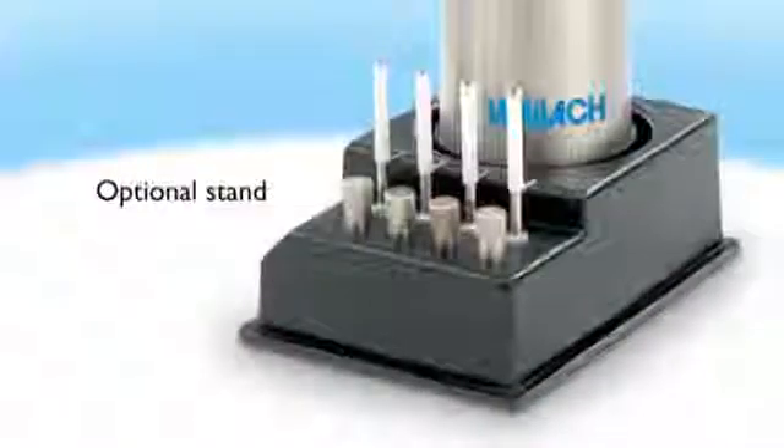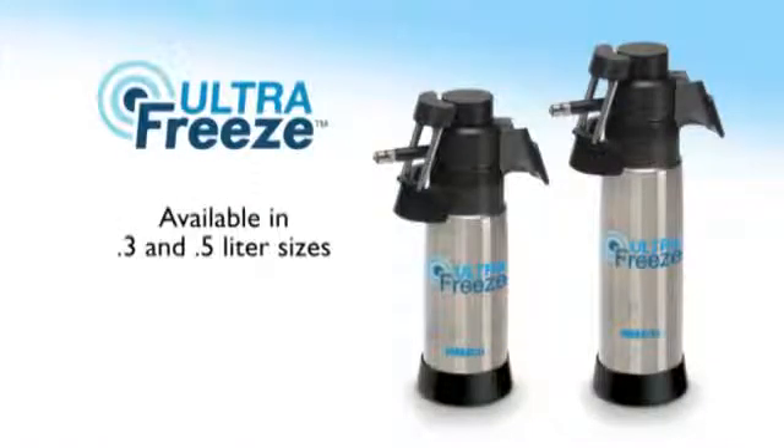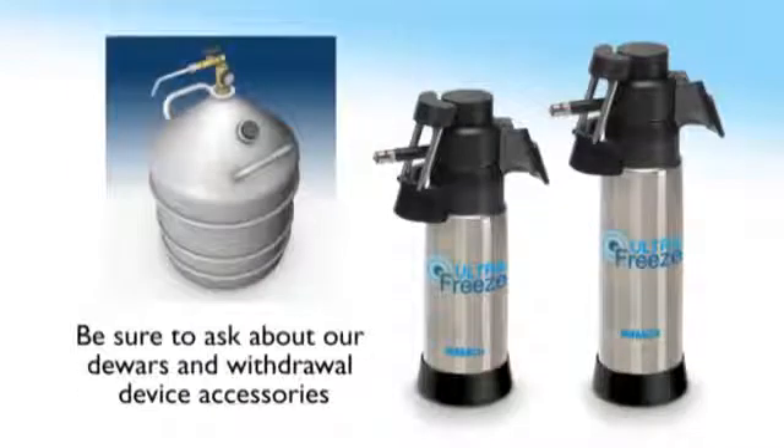An optional stand helps keep the workspace organized. Wallach UltraFreeze is available in 0.3 and 0.5 liter sizes and has a three-year manufacturer's warranty. Be sure to ask about our doser and withdrawal device accessories.